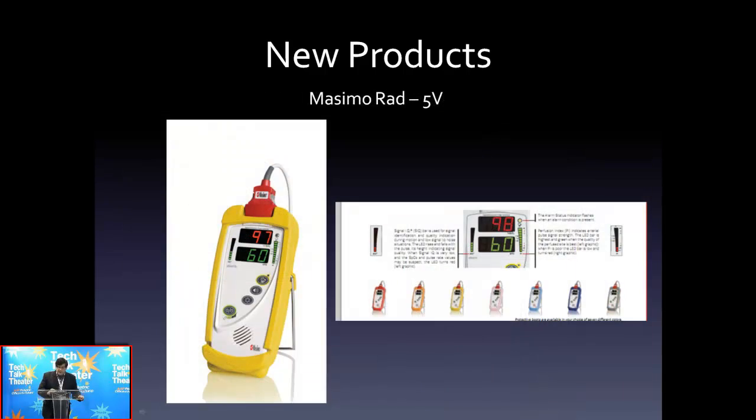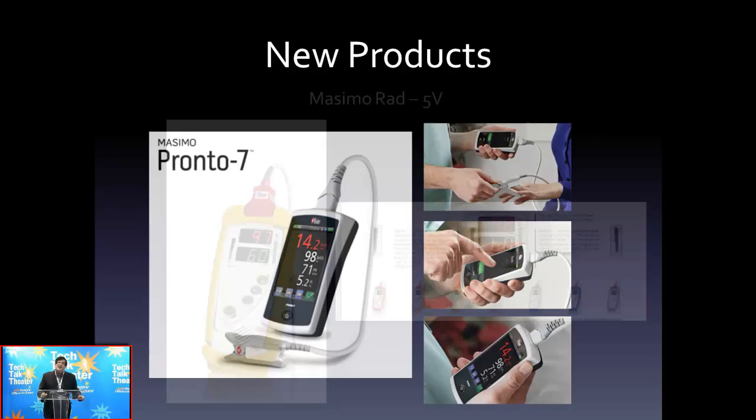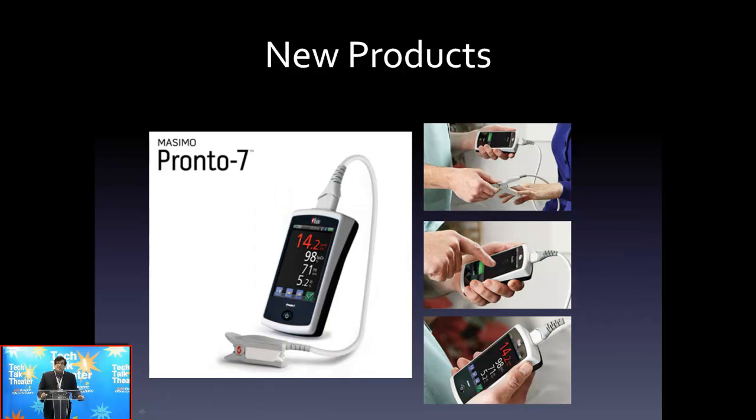And the last device I'll talk about today is produced by Masimo, one of the leaders in pulse oximetry technology. They produce a very sensitive pulse oximeter that one could use in very uncooperative patients, because if they move around and wiggle, it doesn't seem to upset the device at all. It uses special signal extraction technology. And they've devised a mechanism with their upcoming Pronto 7 device that gives you a non-invasive hemoglobin measurement. So this is the first of many devices yet to come that will facilitate diagnosis without needle sticks, without invasive blood draws. And as with other devices I mentioned today, we're waiting clinical data to support their use in the clinical setting.